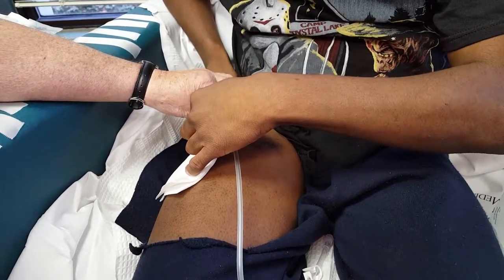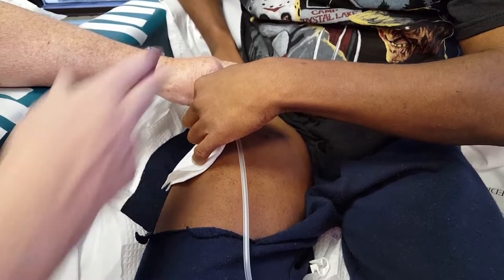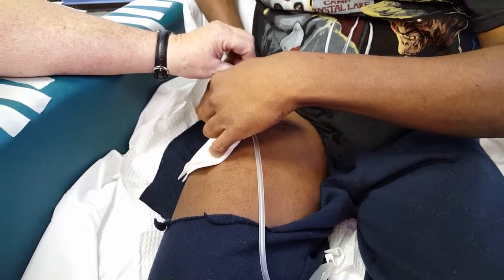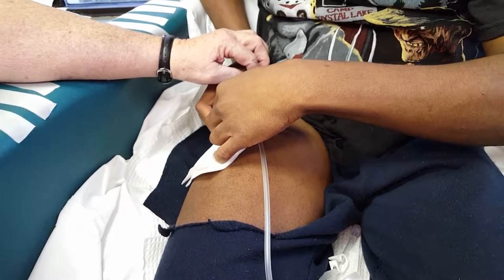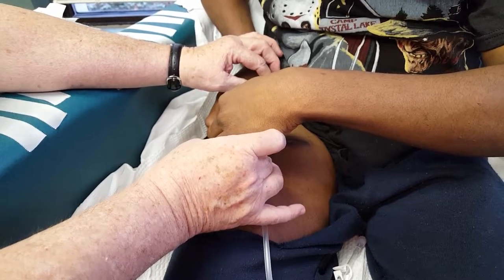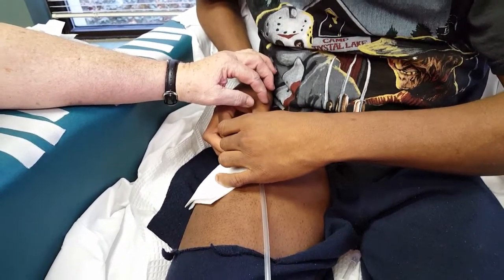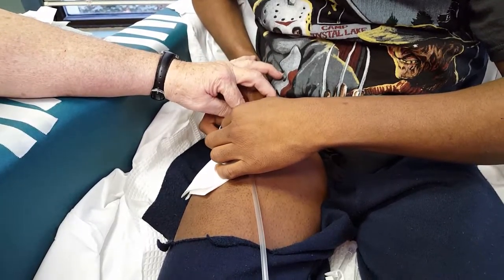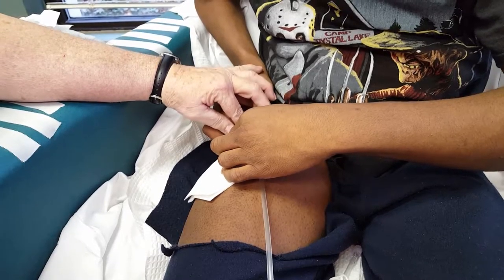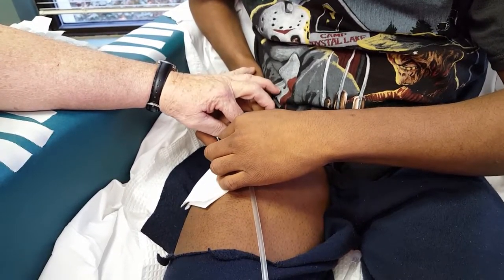Level up? Go towards my index finger. Go towards his finger. This one? Yeah, it's right there. Go over just a little. Right there? Yeah, now go in. Is there any blood? Nope. It's right there.